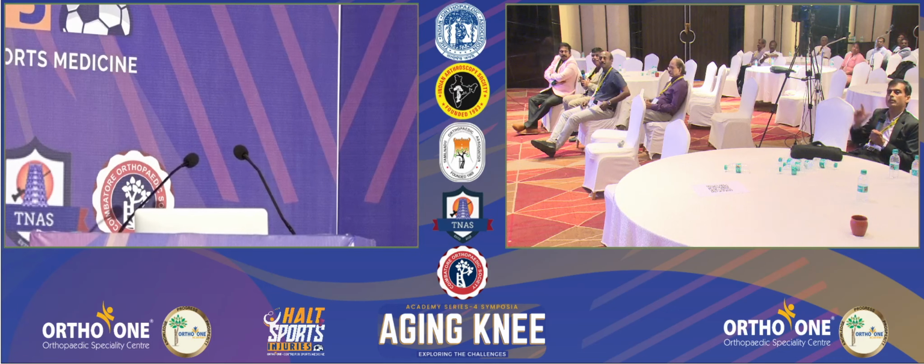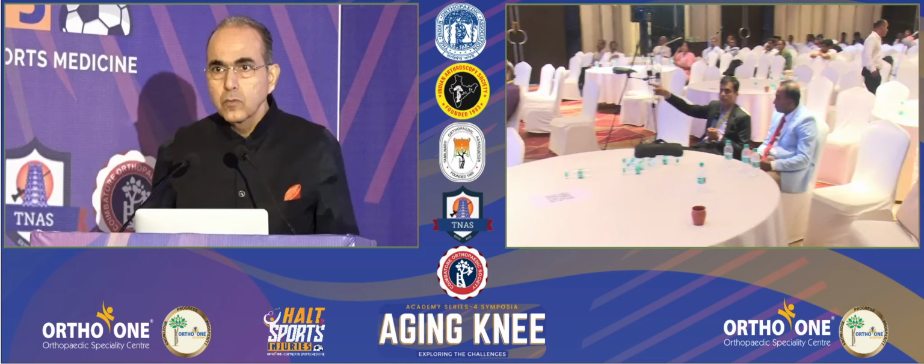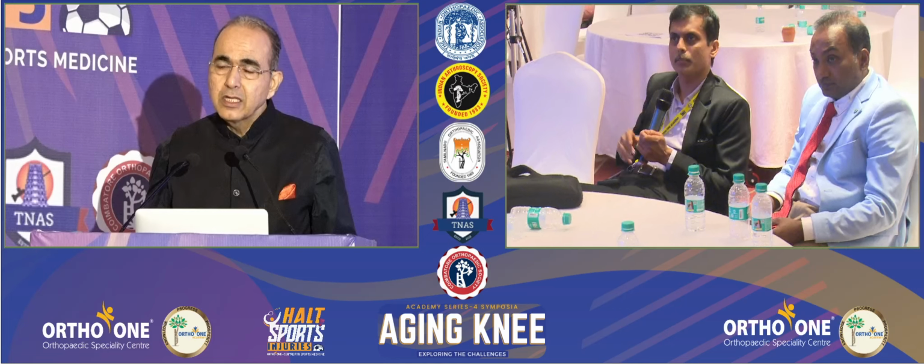Anup, this is with the robot. If you were to do it without the robot, is it the same thing you follow? It's the same. Almost the measured resection, am I correct? I will at least use navigation. I will not do it manually. I don't do it.